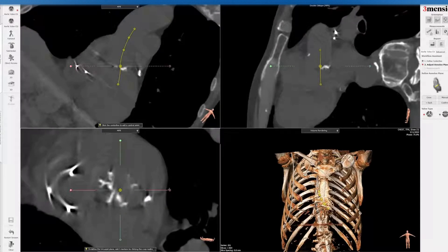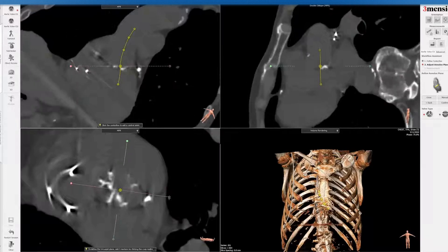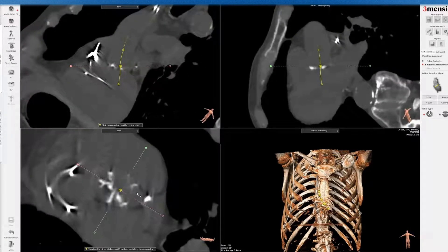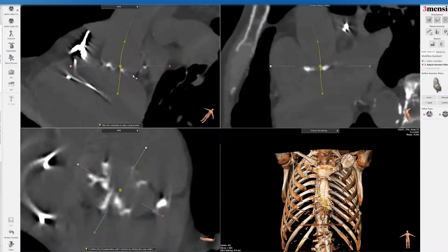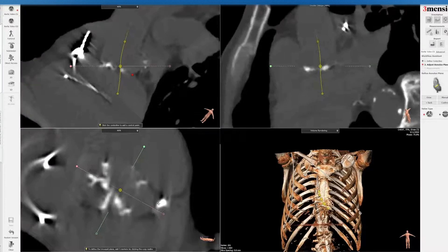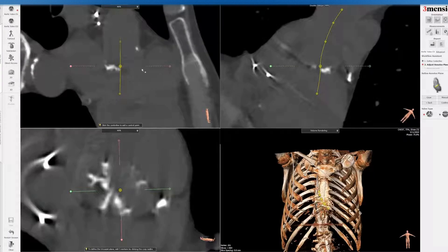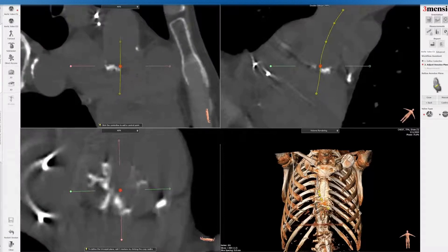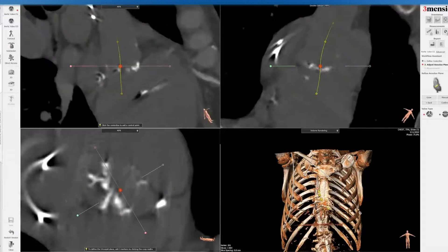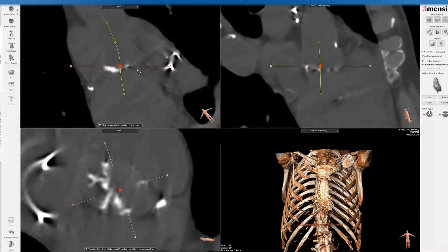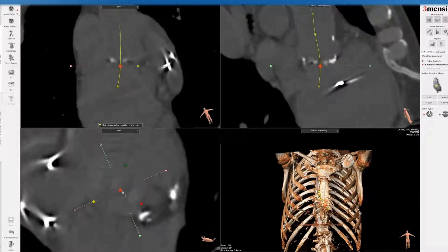But you can still get a rough estimate — you can see there's a tri-leaflet calcified valve. You do a similar workup as for a native TAVR with a CT angiogram. You cut across to the left sinus with the open red circle and put a dot at the base of the left sinus on the top left panel. Remember, this is an estimate, not exactly the same accuracy. Going counterclockwise to the right sinus — that's really hard to delineate. I'll put it down there and show how to make it more accurate, then do it for the non-coronary sinus as well. Now I have a rough estimate of the annular plane.